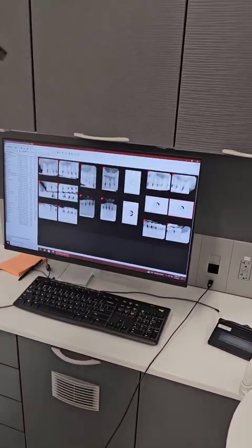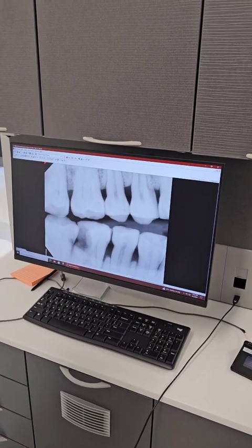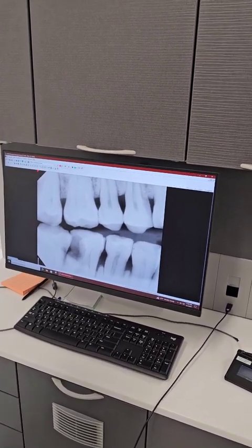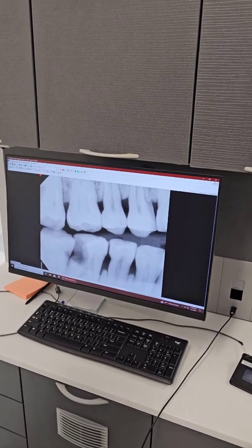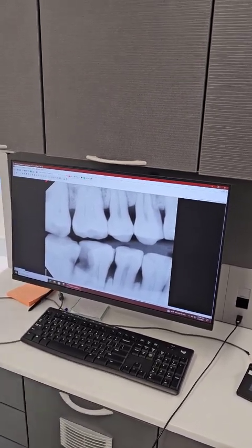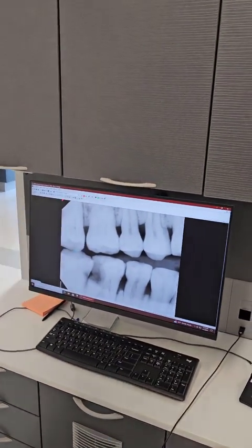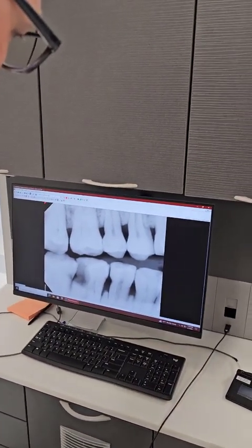Try to line up my horizontal angulation going right through the contacts of the premolars. That looks better. We did get that open contact — about as much as I can, I think we opened up the premolar contacts. If I wanted to capture more of this contact, I'd have to bring it more mesially, and then I'd probably create more overlap between the premolars at the distal.